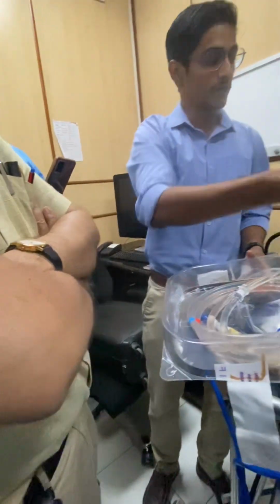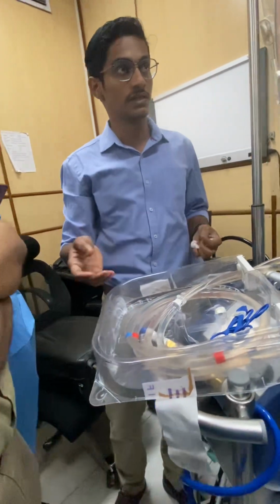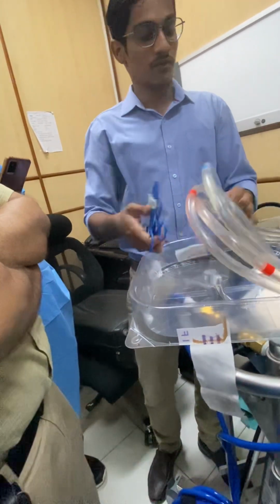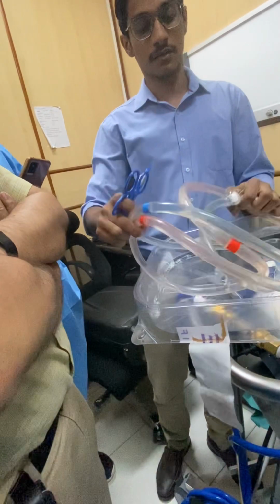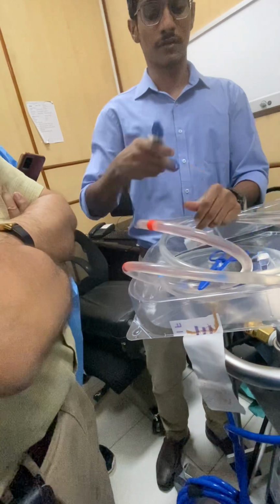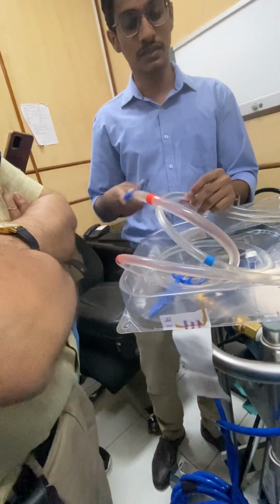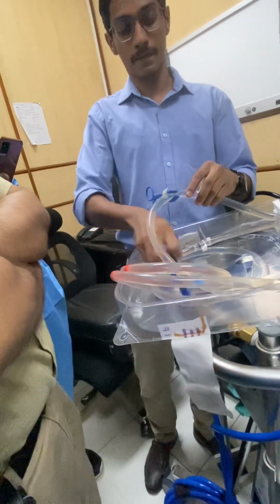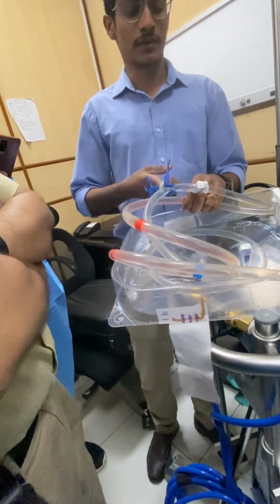Once you have removed it, the sterile person, for example a nurse, will receive it. Once they have taken it, you can see the same kind of connector here. There will be 2 clamps available in this, or you can use another external clamp here.